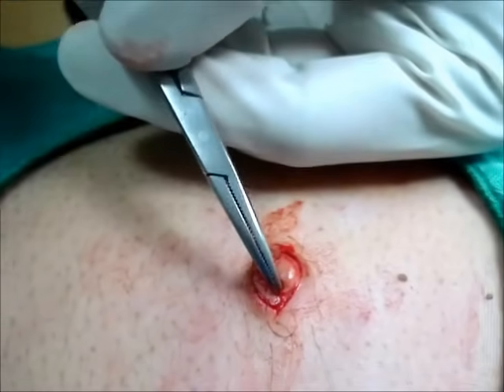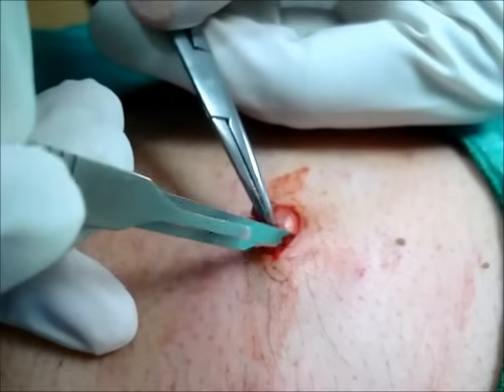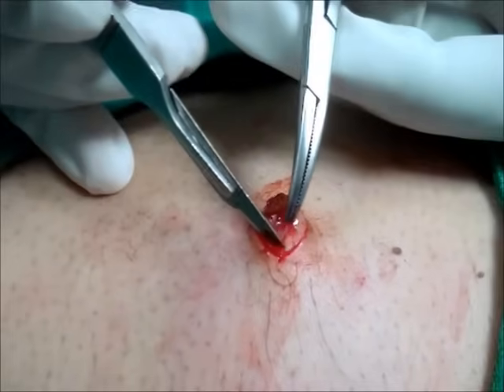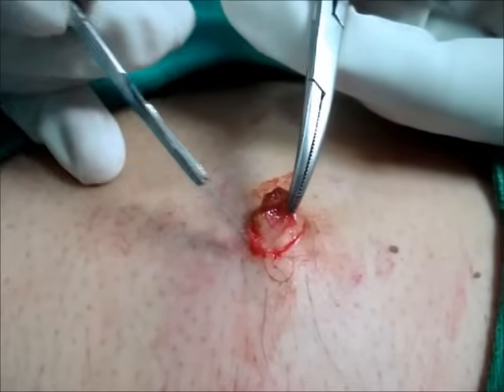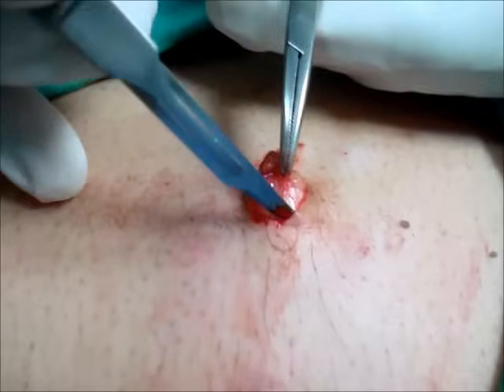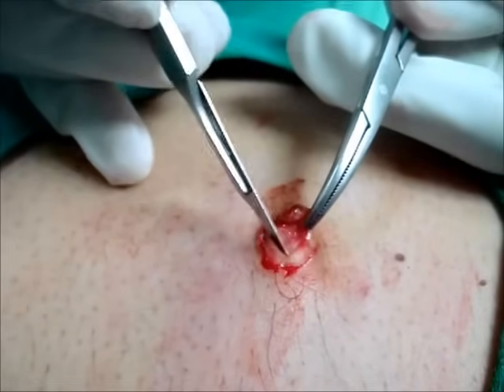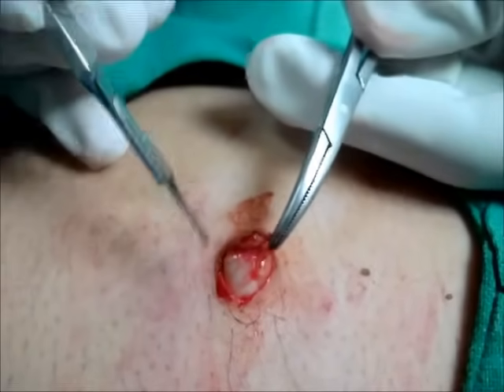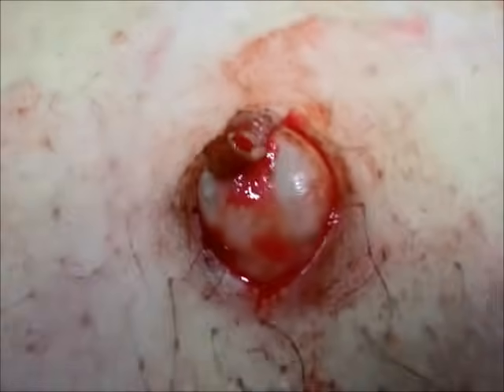We have to hold the cyst wall very carefully. If there is a small fiber layer over the cyst wall, it is to be held carefully and just pulled upward, separating it from the surrounding skin. The dissection should be fine, gentle, and slow — it needs a little patience for complete dissection. You have seen that more than half of the cyst is already out.